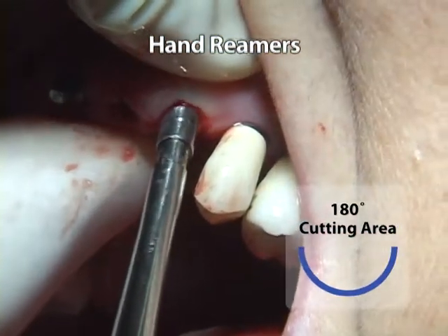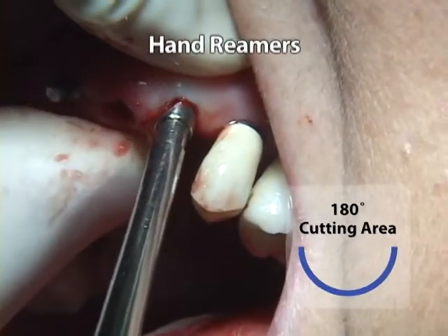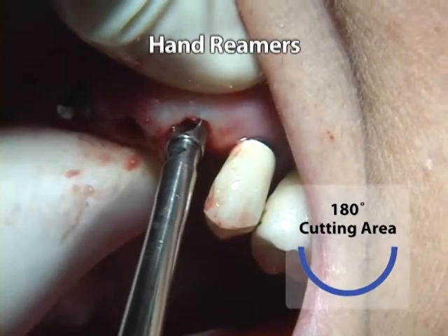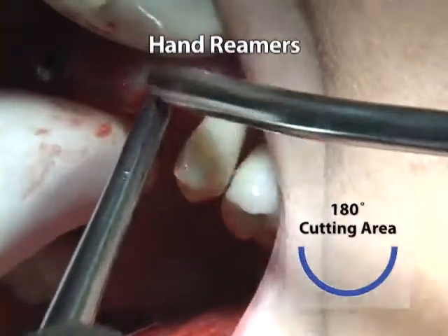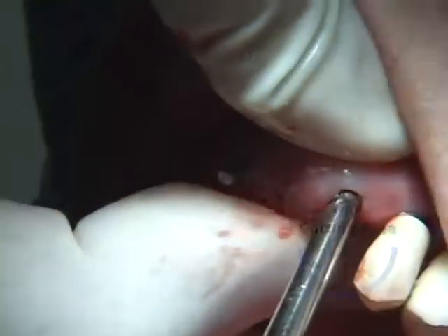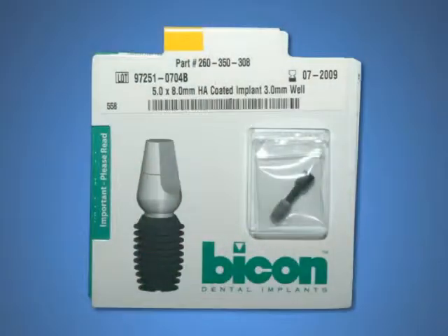A hand reamer's single cutting surface allows for only cutting the palatal side of an osteotomy, while expanding the buccal ridge side of the osteotomy, as it is rotated for only 180 degrees with cutting pressure rather than a full 360 degrees with cutting pressure.